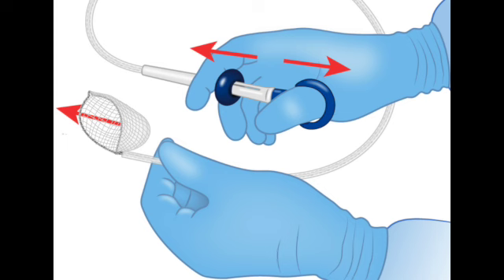That simple logistical detail, the cardboard pinning it, really highlights the journey from removal to diagnosis. It's all about giving the lab the best possible information. And it loops right back to safety, too. Remember that warning about the net? Ripping the mucosa. Yeah. The reason that careful, collaborative net operation is so stressed is because a mistake, a rip, creates an immediate problem: bleeding, maybe even a perforation, avoidable complications. So careful handling, preserving orientation, avoiding injury, it's all part of the same commitment to patient well-being and accurate diagnosis.